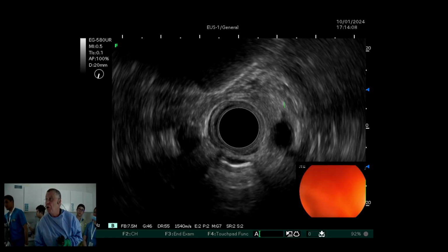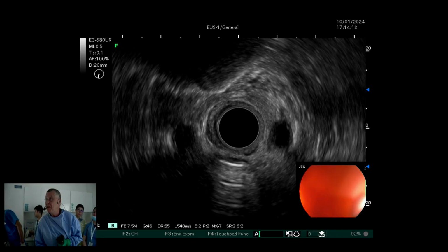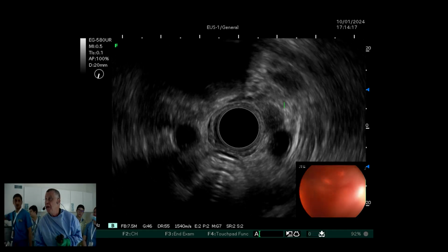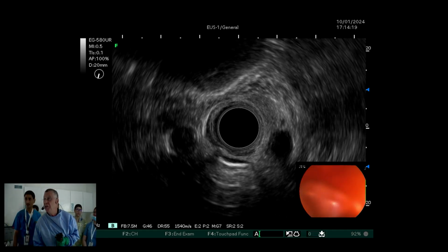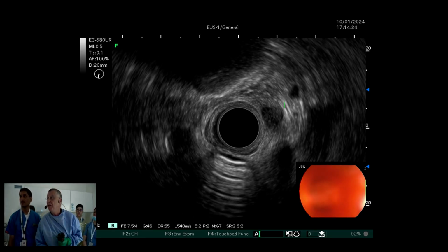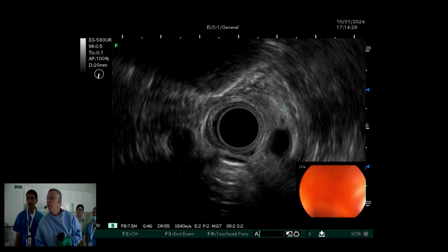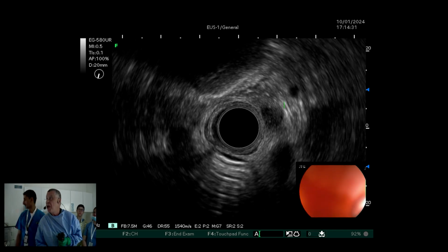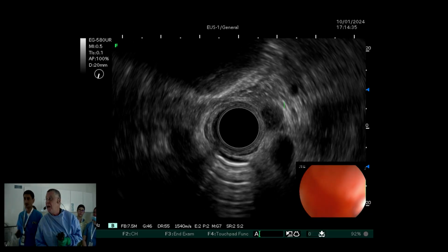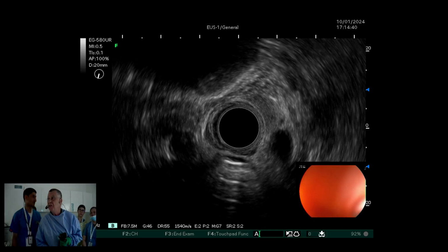stenosis. But all the published series on this kind of case demonstrate that at the moment where they had no neoadjuvant therapy, it was only surgery. So we have the comparison with EUS and surgery without neoadjuvant, and it was always T3. So when you have a stenosis, always T3. Push an upper GI endoscope before doing EUS, and the stenosis is unpassable.